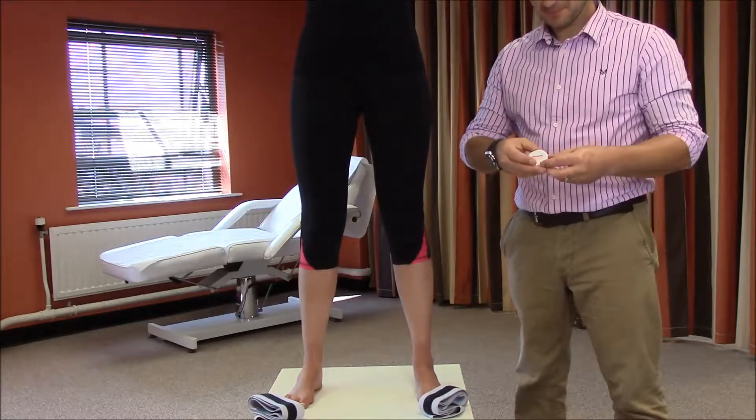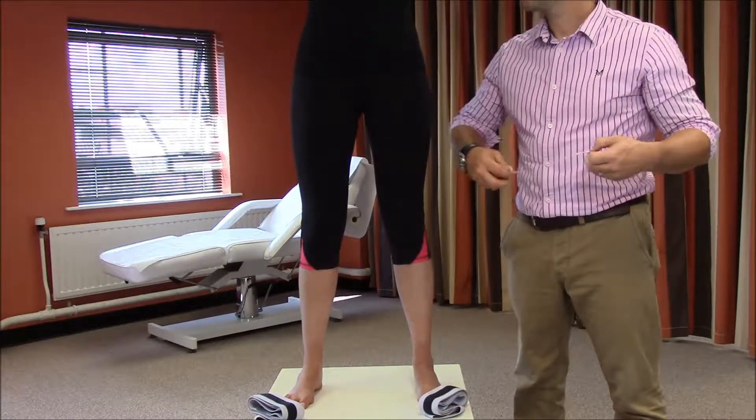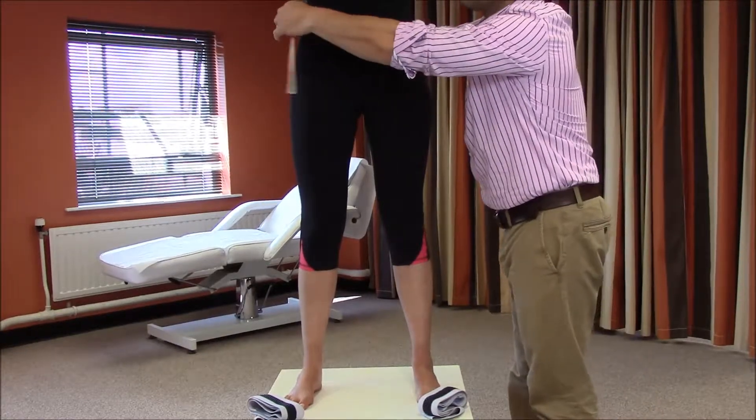In order to find the most appropriate size derotation band, begin by measuring the waist circumference in centimetres.